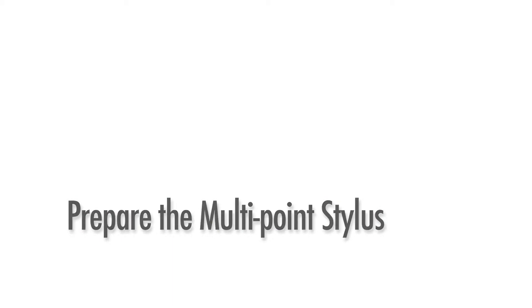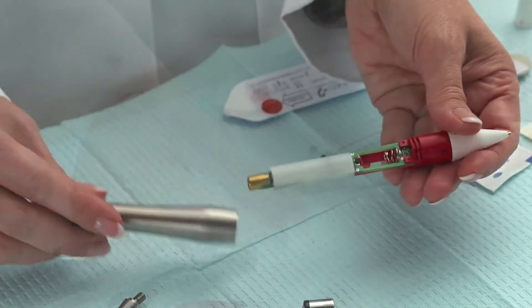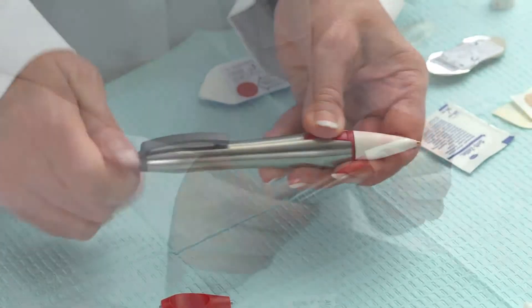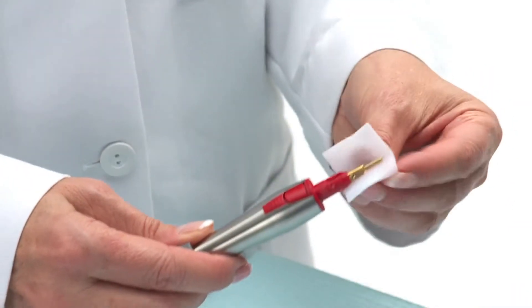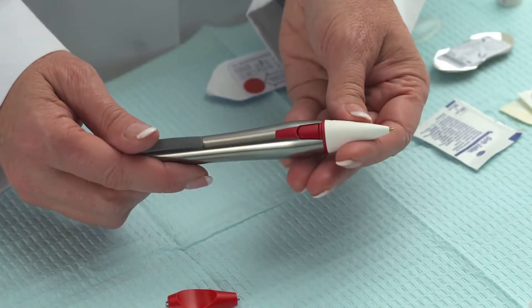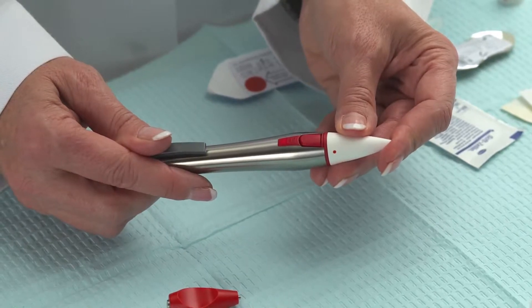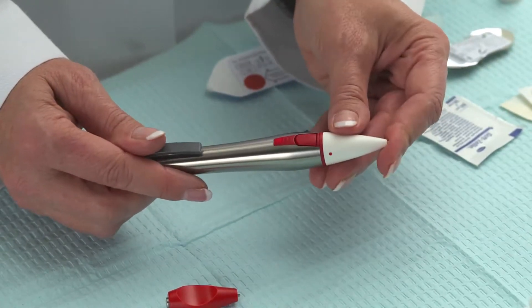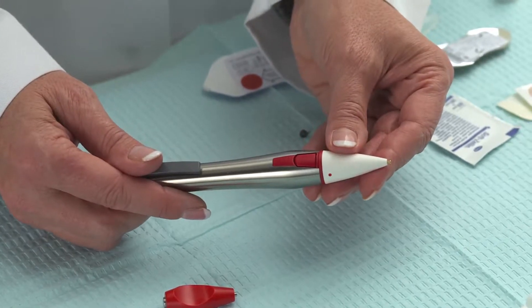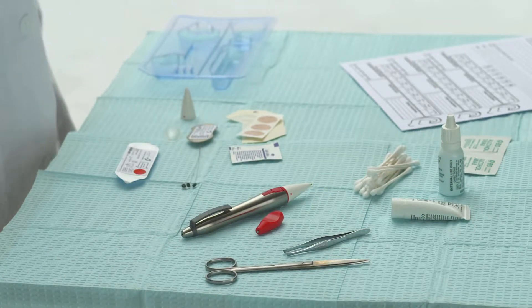Prepare the multi-point stylus. Remove the outer casing of the multi-point stylus, insert the battery and reassemble. Clean the tip with an alcohol pad. Screw the end cap one quarter turn clockwise. Press the tip to engage the red light to assure the stylus is properly functioning. Clean the tip with an alcohol pad. Once the p-STEM placement is complete, remove the battery to save battery life.